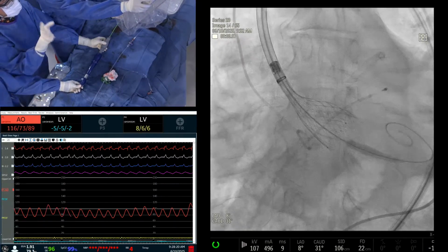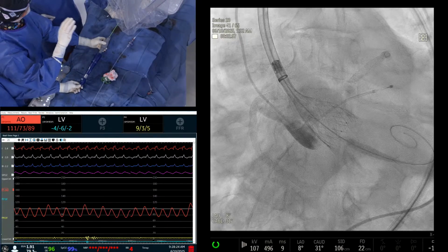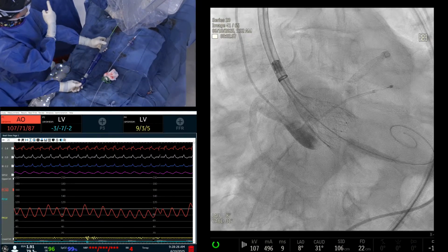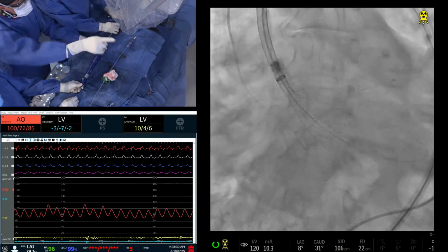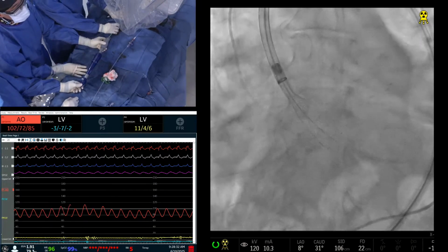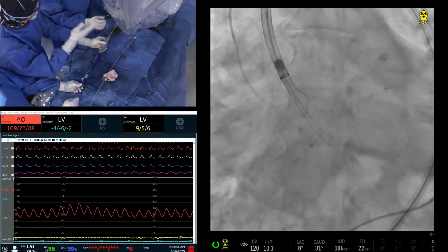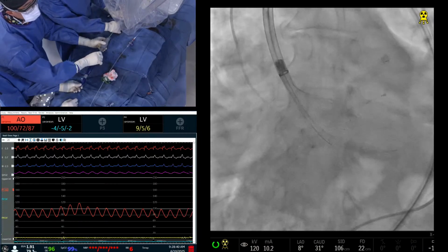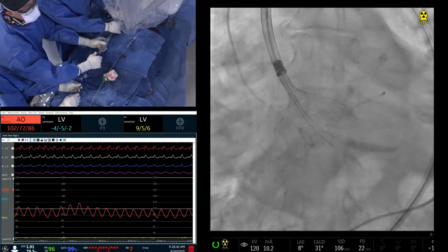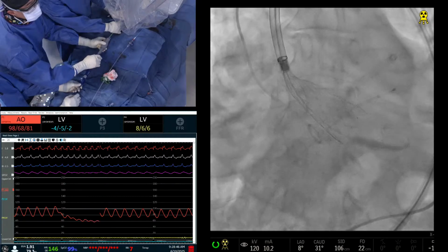And then the other important thing that Dr. Sharma has taught us is that if you want to post-dilate, you have to not implant too high. And Dr. Kinney also mentioned that before. It's very important to tell the audience. Dr. Kinney, you want to mention that if you implant too high, you get the D sign, then you cannot post-dilate, right? Absolutely not, you're not able to post-dilate. 150. Because we know we're going to post-dilate on this one for optimization.